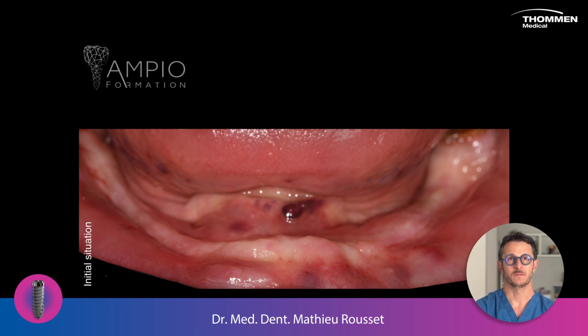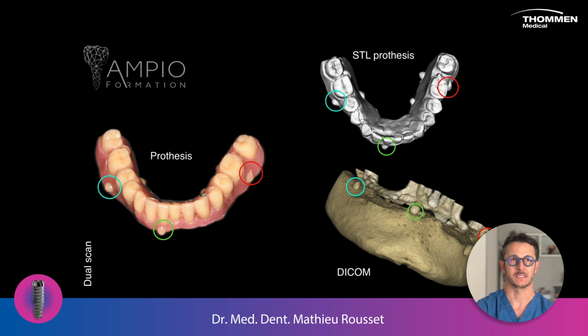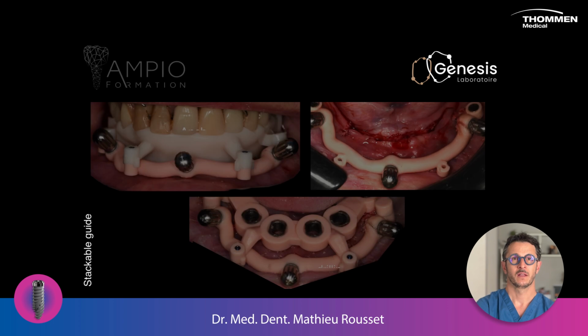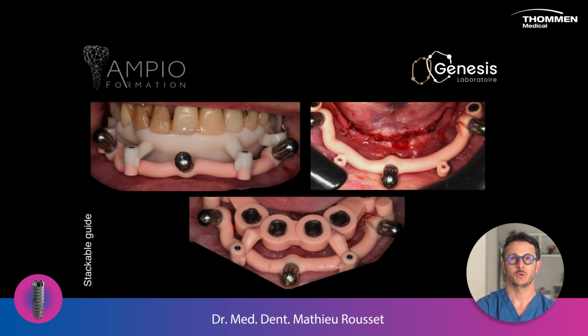The patient had no teeth, so we made a dual scan with radio-opaque devices. Stackable guides are made by the prosthetist as in the previous case. The only thing that will change is the drilling protocol. In this case, it's essential to carry out the full drilling protocol. Implants mustn't be too compressive on the surrounding bone.